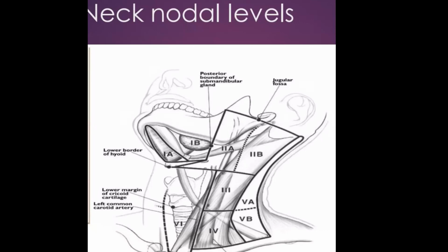Now, when you give these levels in your reports, whoever is referring will know that this person knows what he or she is doing, that you're guiding them. It's a clinical report. You don't just say there's a lymph node in the right side of the neck. You have not helped them. You've confused them. And you don't want that patient to come back again and pay for another scan. So it is very, very important.